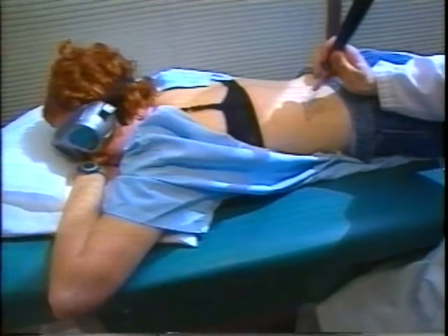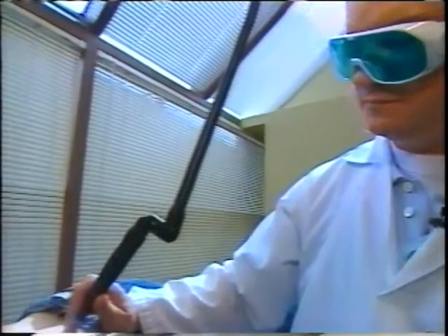The energy from the laser comes down the arm and onto the skin and actually delivers the type of energy that explodes the pigment. It causes a photoacoustic effect, so that you can see the pigment fading away right before your eyes. Now, I notice it is turning white. Yes. Why is that? What happens is there's a little frosting that occurs on the skin as the laser energy attacks the pigment. It forms a little frosting like you would see on a cupcake, and that forms a little crust. It then comes off in about 6 or 7 days, and then the tattoo is faded.